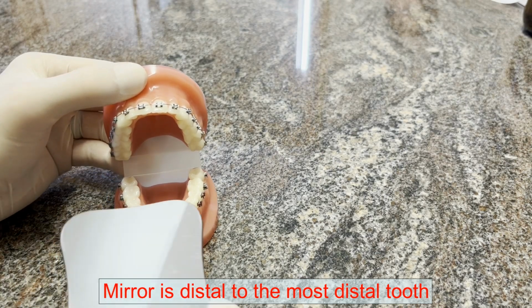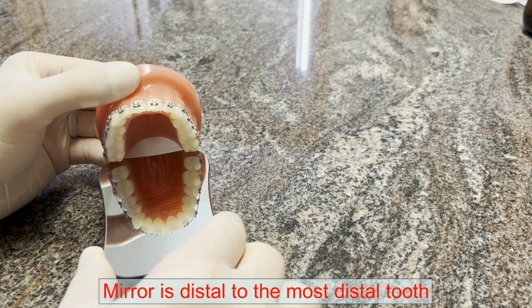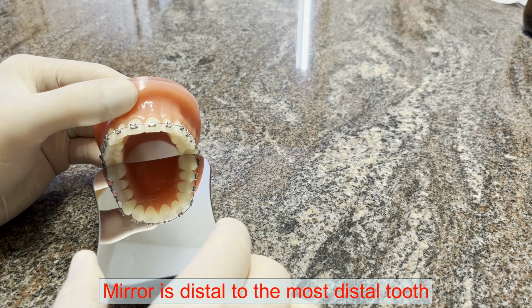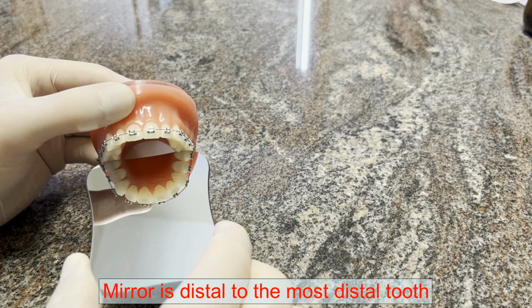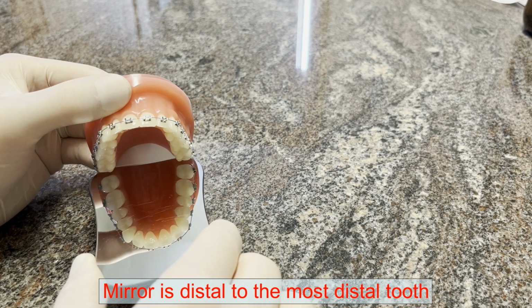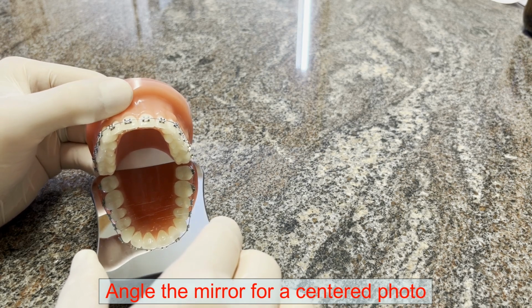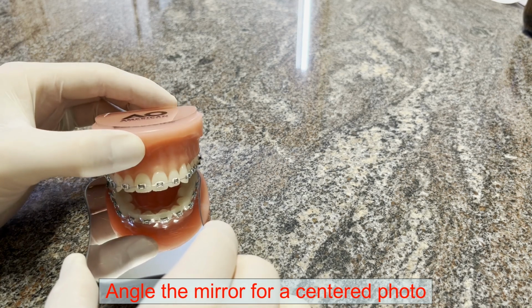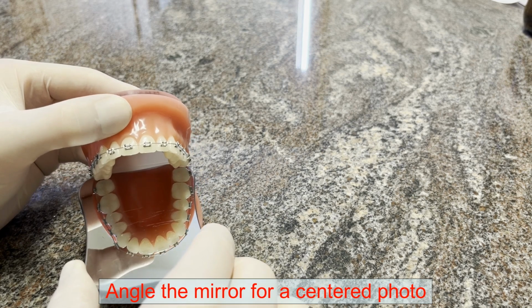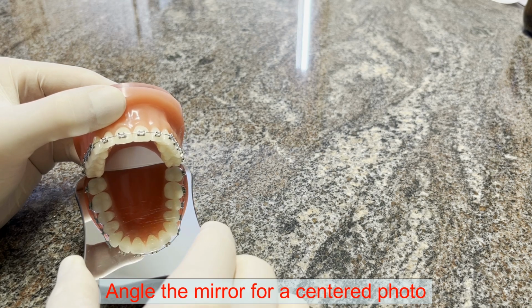So when you're sliding the mirror into the mouth, you need to put the mirror distal to the most distal thing you want in the shot, because the reflection in the mirror is what you're going to capture. So if you only put it in like that, you'll only get the first molars. If you put it in like that, you'll only get the premolars. So you have to put the mirror distal to the most distal tooth like this. And then you angle the mirror so that you're looking straight down on the arch like this. If they don't open enough and it's like that, you can't get a good shot. They have to open really nice and big, and then you get that mirror in there distal to the sevens and angle it so that you're looking at all the arch nice and centered.